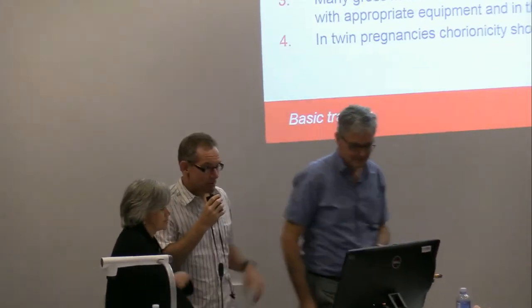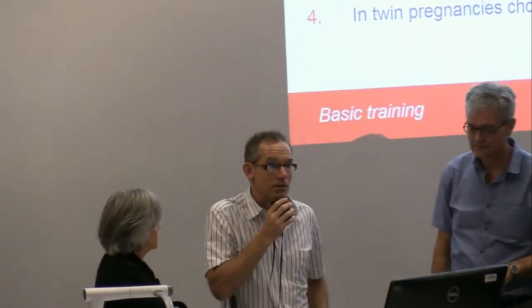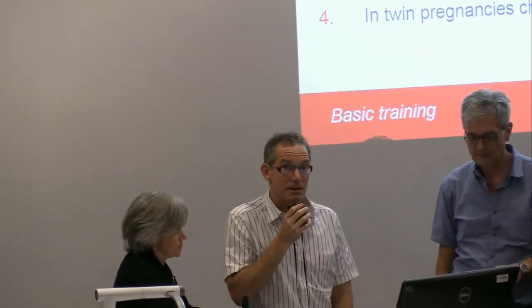Once again, it depends on whether it's premenopausal or postmenopausal. Any fluid in the pouch of Douglas in a postmenopausal woman is abnormal and needs investigation. In the premenopausal woman, I mentioned the different levels. If you're seeing fluid up to the fundus of the uterus, that's abnormal. If you're seeing fluid in the anterior uterovesical pouch, that is abnormal. And obviously, if you're seeing fluid high up in the abdomen, around the liver and the kidneys, that is abnormal.